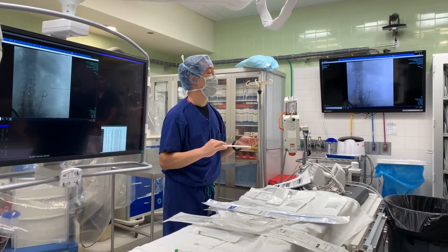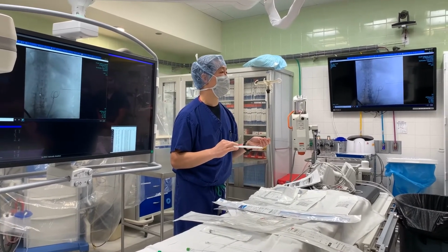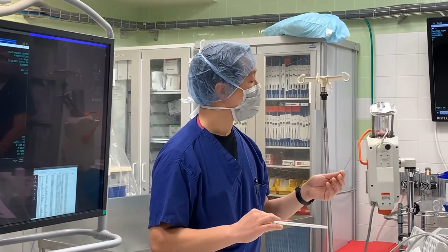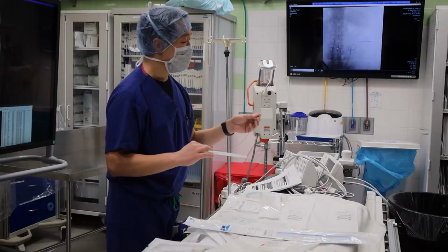You can use a Rosen, you can use an Amplatz, you can use a Glide. And then there's other 035 wires that are a little bit more exotic that probably we shouldn't be using, okay? At least not for basic things like this.